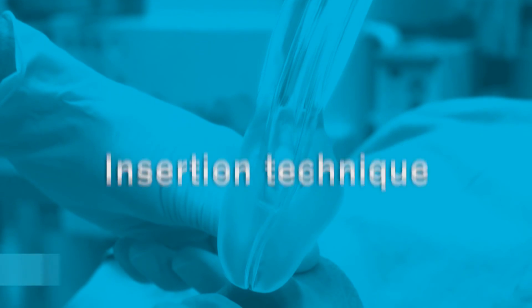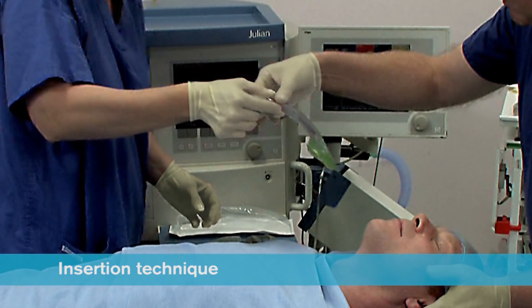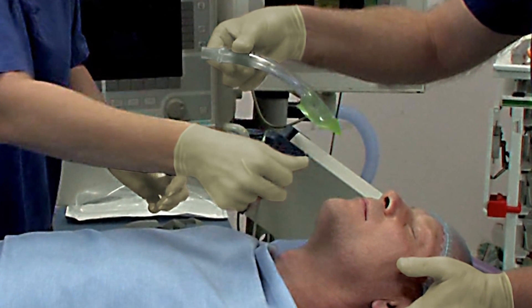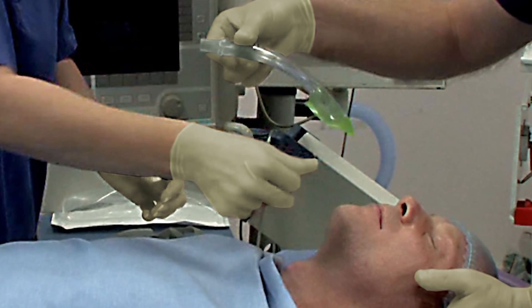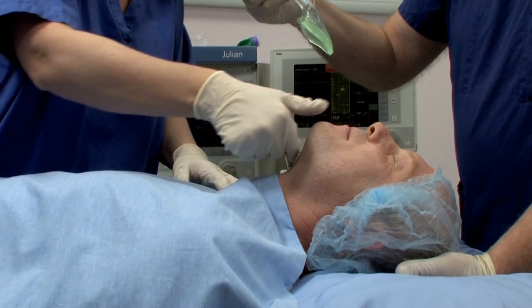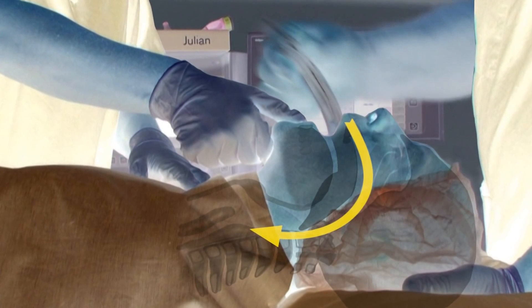A proficient user can achieve insertion in less than 5 seconds. Remove the iGel from the protective cradle or cage pack and grasp it firmly along the integral bite block. Position the device so that the iGel cuff outlet is facing towards the chin of the patient. The patient should be in the sniffing the morning air position with head extended and neck flexed. The chin should be gently pressed down before proceeding to insert. Introduce the leading soft tip into the mouth of the patient in a direction towards the hard palate, then glide the device downwards and backwards along the hard palate with a continuous but gentle push until a definitive resistance is felt.